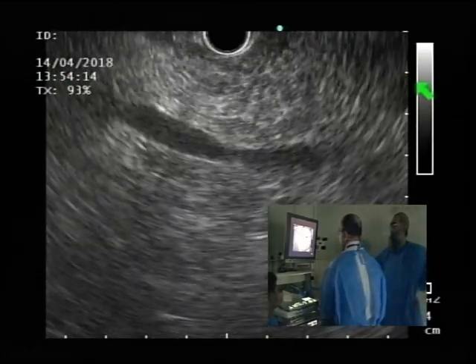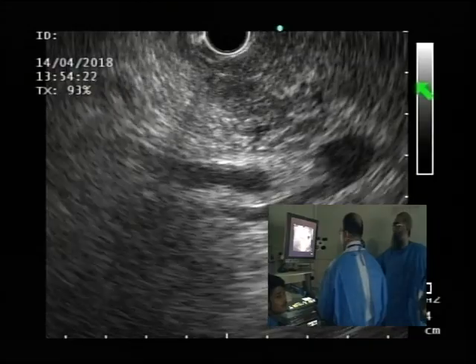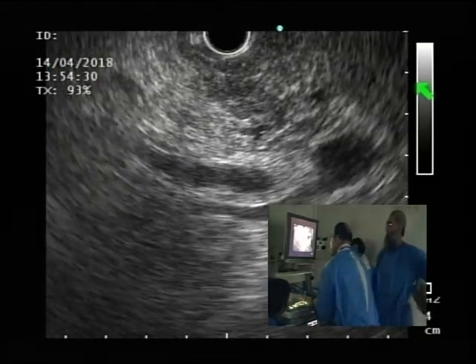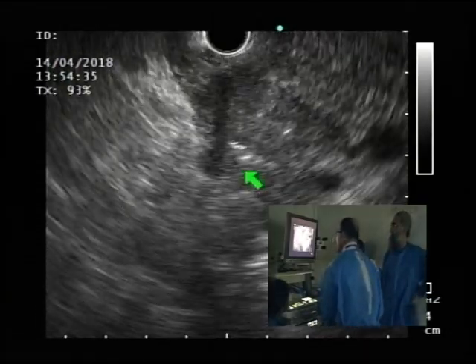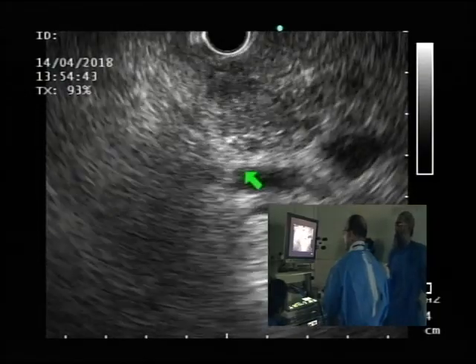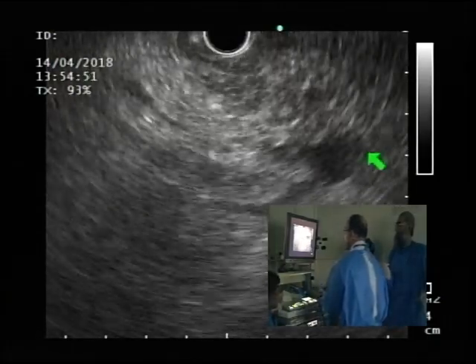Usually the SMV is closer to the pancreas, and the SMA is a little farther. Absolutely. So here, this is the A, and you can see the slightly thicker wall on it too. Khalid, you're absolutely right. I'll just show you the V as well. This is the A with a thicker wall, and as I go more clockwise, this is the V, which is closer. So V, A. And the V is coming into the confluence to the right here. It's joining to form the confluence.